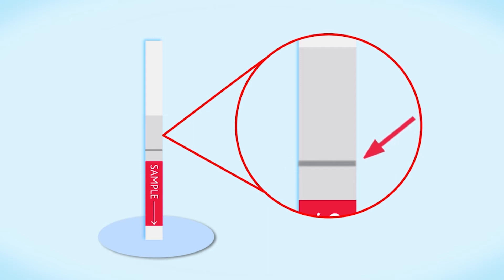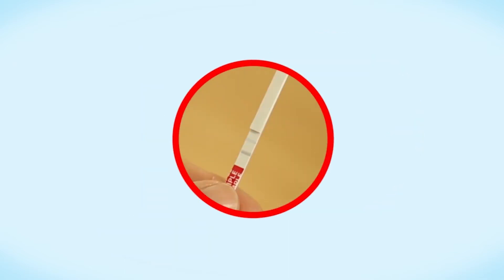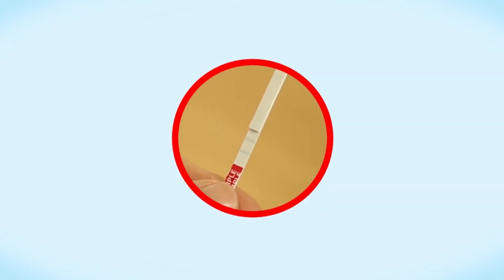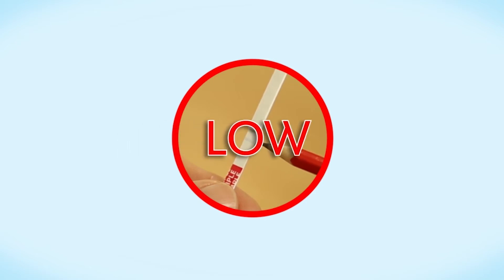The test line is nearest the red label and shows whether your cow has high or low levels of progesterone. Compare the test line with the control line. If the test line is darker than the control line, or the same as the control line, your cow has low progesterone.